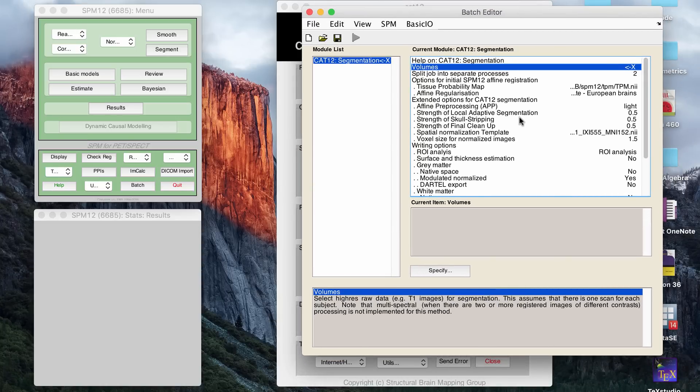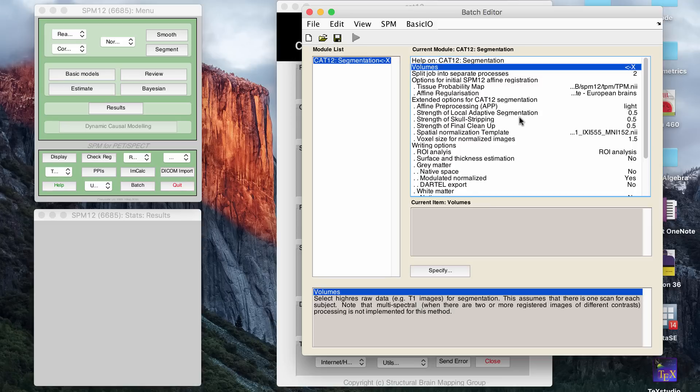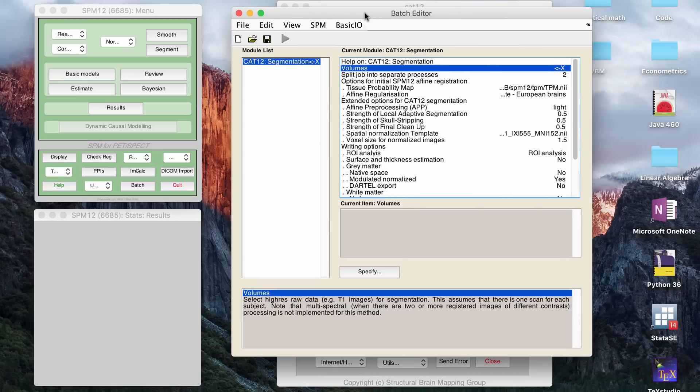So you segment through CAT12. If you're familiar with SPM, it's kind of a similar GUI, so it gives you so many options that you can customize. A lot of these, especially if you're just running it for the first time, you're just going to keep the default ones, which I do a lot, but you just want to change a few things.